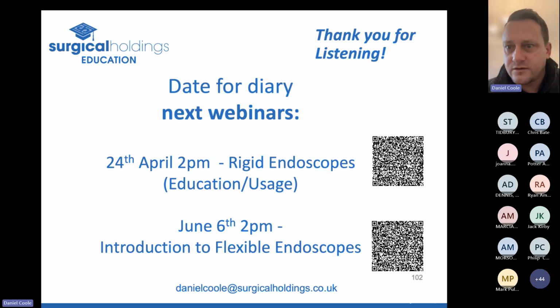So Chris has asked, material selection has prompted me to think about appropriate device marking technologies for applying the UDI measures. I'll be interested to hear your experience. Yeah, so Chris has made a comment about applying marking technology for UDI and how that is affected when you're thinking about marking the device. It is a challenge, and that is something that will be even trickier, I think, when you're marking a device with a UDI, a surgical instrument, and then you're putting it out there and it's going into use for maybe 10 years, and then revalidating that mark. How are you going to do that?